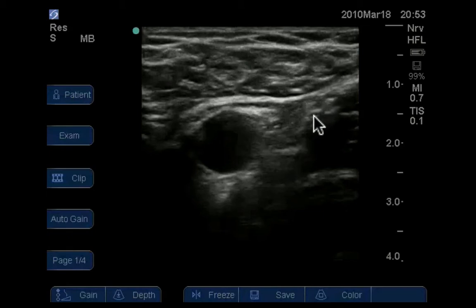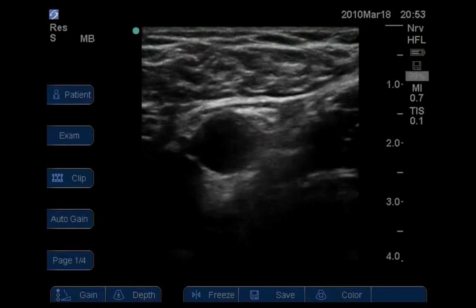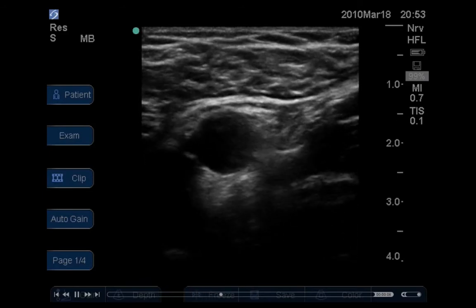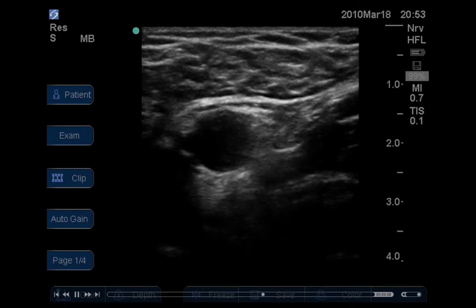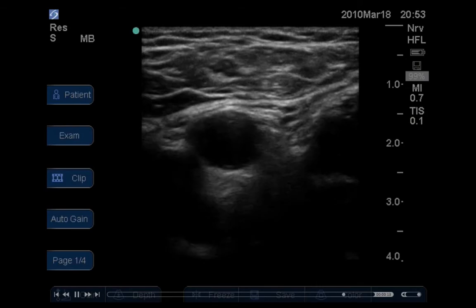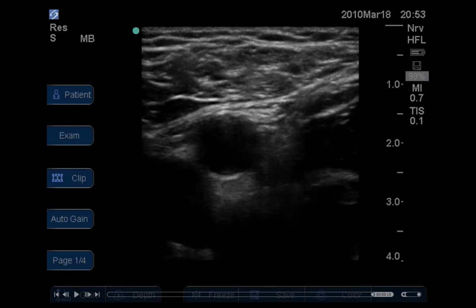And in this clip, the patient is just gently flexing the hip, so activating iliopsoas muscle, and you can see that it delineates it from the fascial layers above. So there's femoral nerve there. Which is a little bit more lateral than you might expect if you just went for the tip of the triangle lateral to the femoral artery.